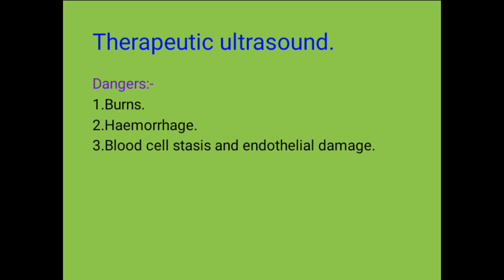Number 2, hemorrhage, which is excessive bleeding. Perhaps you might find a patient with an injury or a wound which is bleeding. When you apply therapeutic ultrasound, remember it will increase blood flow. So this will lead to fatal consequences, thus hemorrhage.